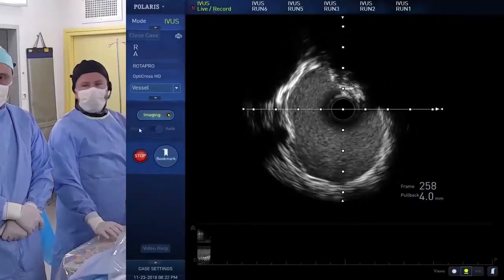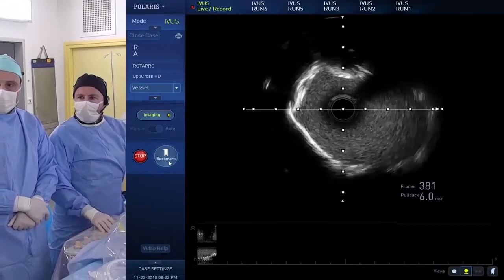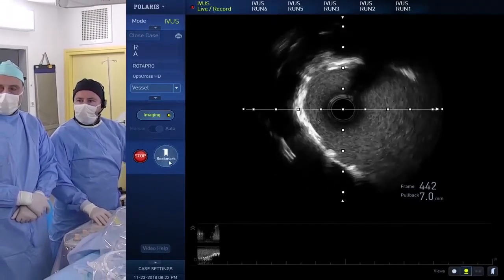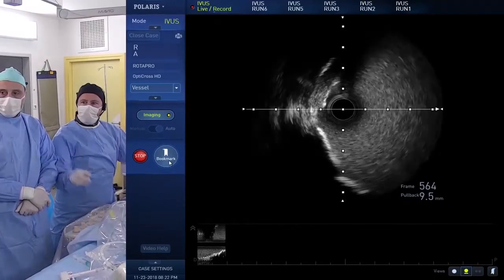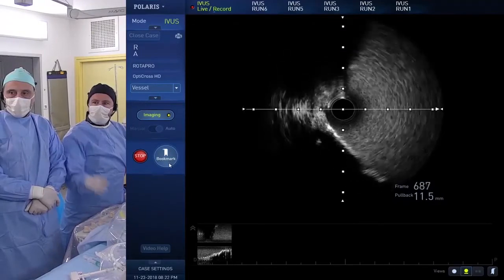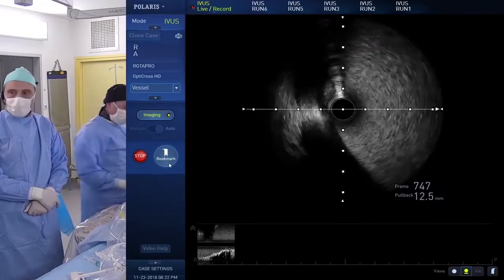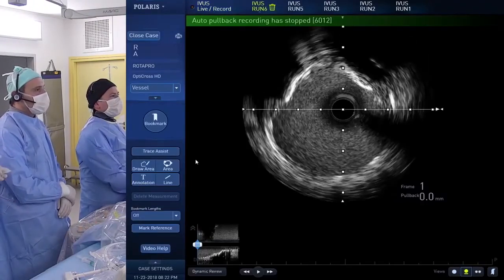There's been a comment about whether the ostium of the left main does have any stent struts. Yes, it has. You can see there is a strut inside the aorta. At this part, you can see the strut. It is definitely improved. I think this is okay. Yeah, I think so too.